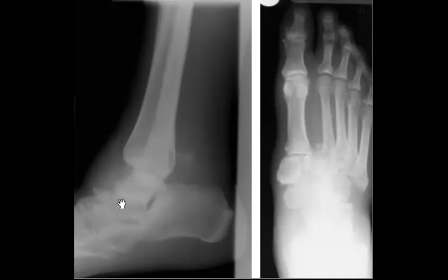And always when you find the Charcot joint, yes, thank you. So when you find the Charcot joint, you will think about Lisfranc. And when you find Lisfranc, ask about trauma. If you don't find the trauma, then go search for Charcot. Okay, so they are together.